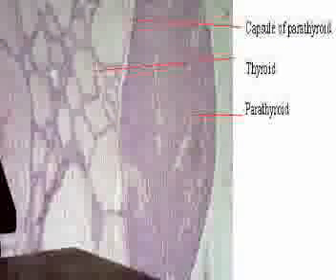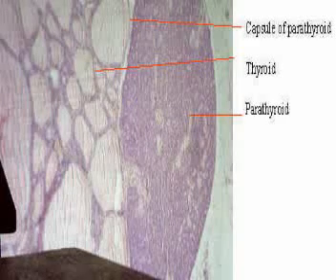Parathyroid gland has anastomotic cellular cords as opposed to the hepatic plates. It can easily be confused with the liver. It is embedded in the thyroid gland and separated from it by a capsule. Differential diagnosis.